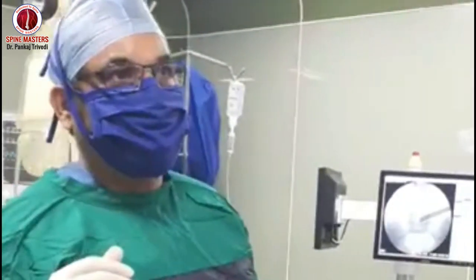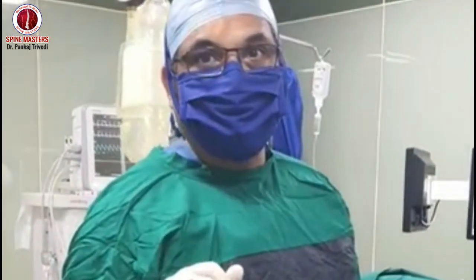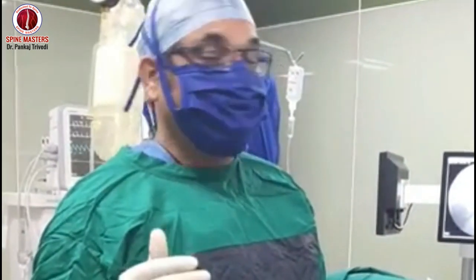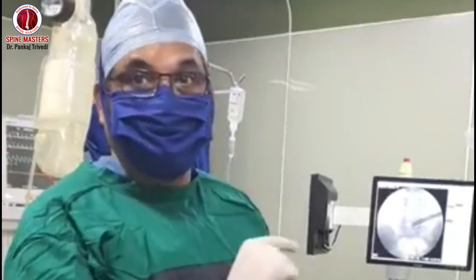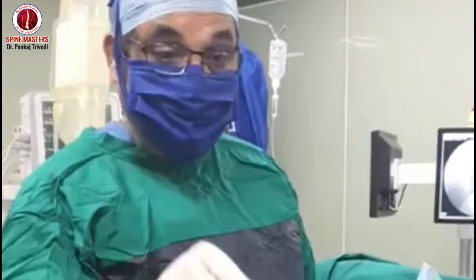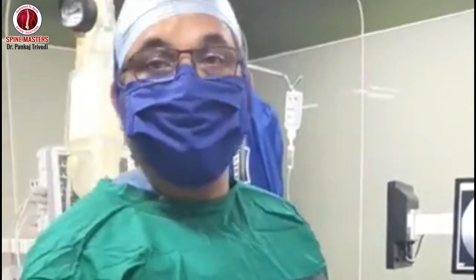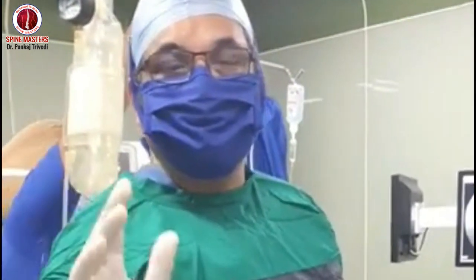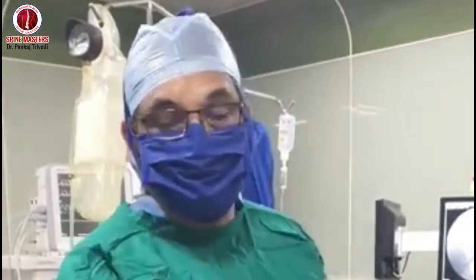It took around 30 minutes. The whole fragment is removed. It was a very big fragment. She was not able to walk for around 6 months to 1 year, and the problem was backache and leg pain. Now the beauty is that under local anesthesia she is not complaining of any pain, and the whole fragment is out. She was not able to walk before, hardly a couple of minutes. Now after surgery, she is really back to her life. That is the beauty of endoscopic disc surgery, and majority of lumbar discs you can do with the endoscope, whether they are central, paracentral, foraminal, extraforaminal, upward migrated or downward migrated.